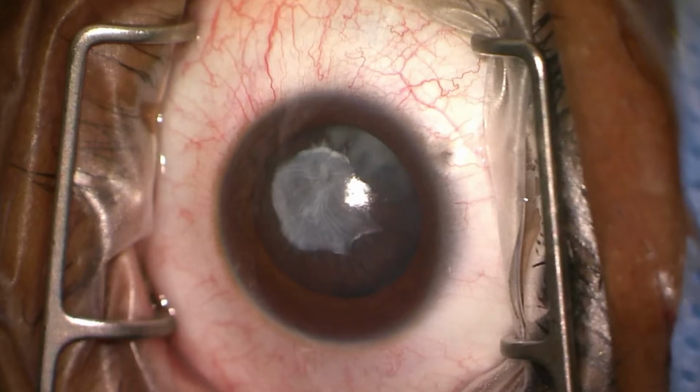And it's my hope that we could tear along the margin between the plaque and the iris, but I'm concerned that that's not going to be possible. Let me show you some things that stood out to me when I began this case. The things that stood out to me are these stria, all right? I hope that you can see that they're kind of arcuate. There's some sort of a twisting anatomy that's happened as this plaque is developed. It's not something that was present since the individual's infancy.